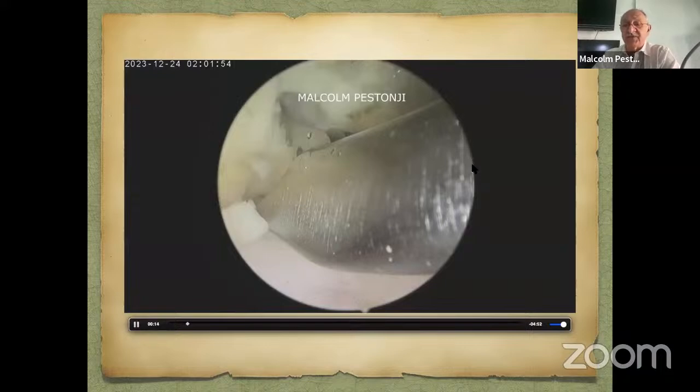This is the immediate post-op CT, which you can see. There's even a gas bubble there. So there is nothing else in the paraspinal muscles there. Now pause and see this bony window. I'm going to pause this so you can have a look at the bony window and tell me how big the bony window is post-op.